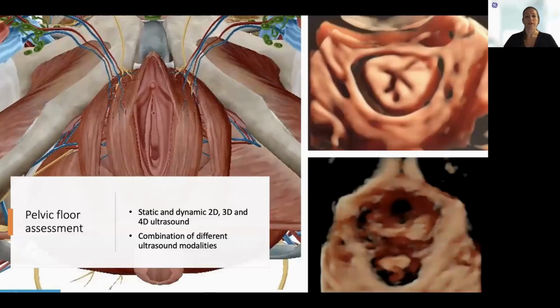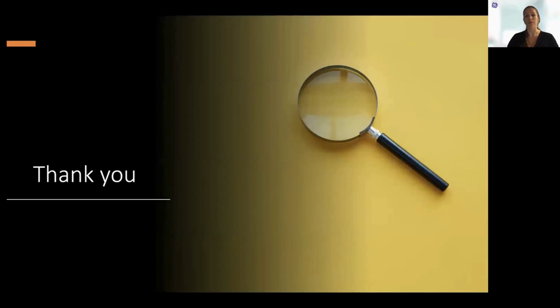So in this lecture, I have showed you that pelvic floor can be assessed using static and dynamic, 2-dimensional, 3-dimensional, and 4-dimensional ultrasound, and of course, different modalities may be combined. I want to thank you all for being with me and listening, and I hope you will enjoy using ultrasound and scanning pelvic floor in your practice.